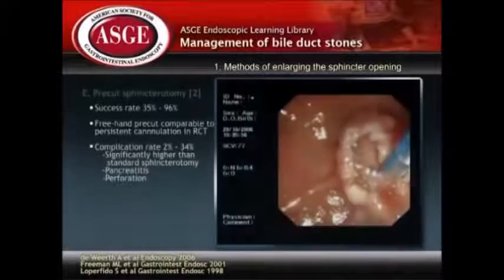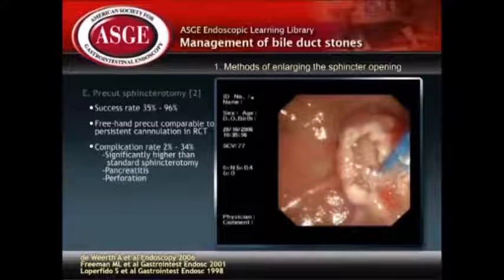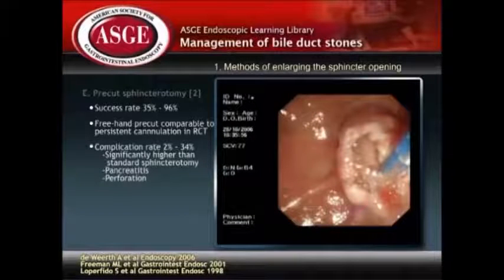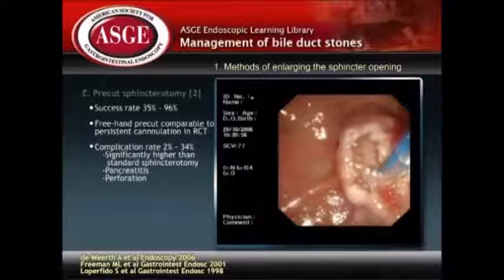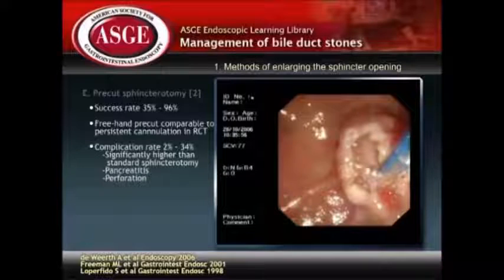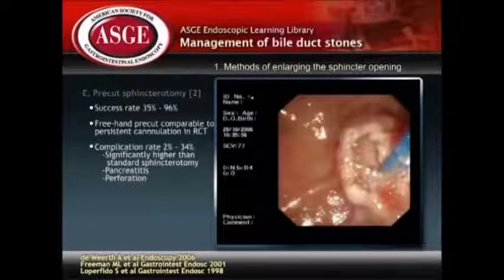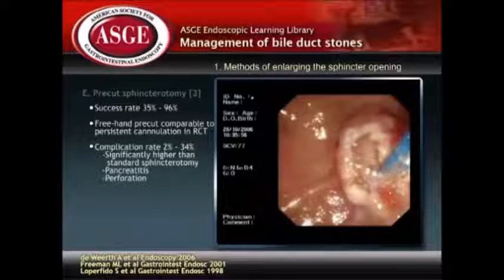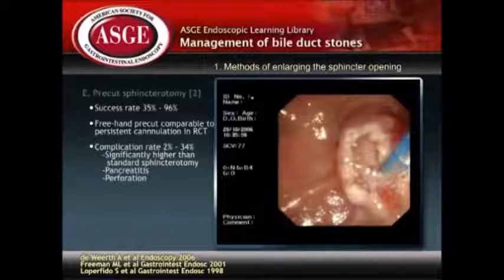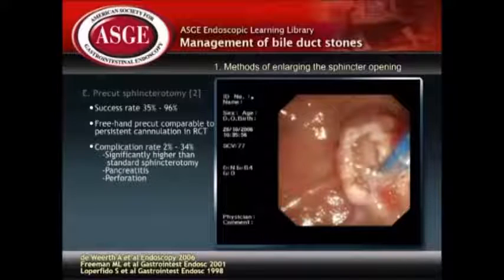The overall rate of success in gaining biliary access after pre-cut sphincterotomy ranges from 35 to 96%. Randomized studies have shown similar rates of biliary access by the freehand needle knife technique as compared to persistent cannulation. However, the pre-cut approach is associated with significantly more pancreatitis and perforation than standard sphincterotomy.